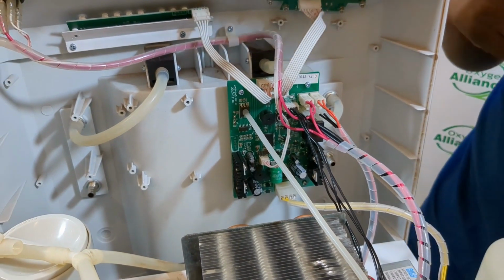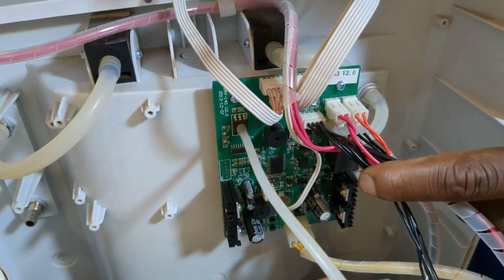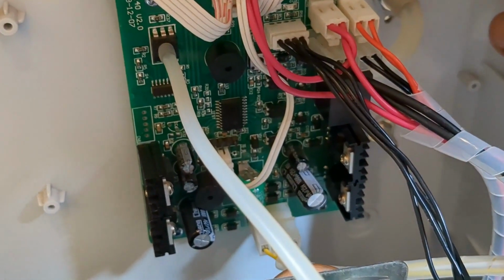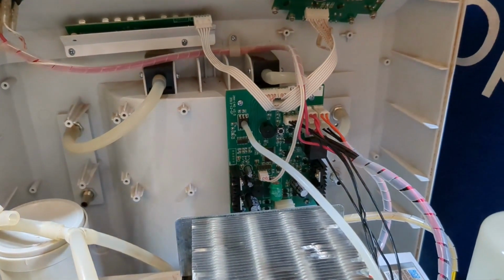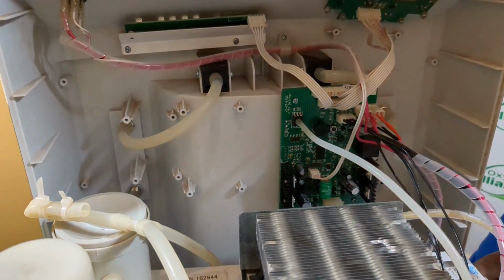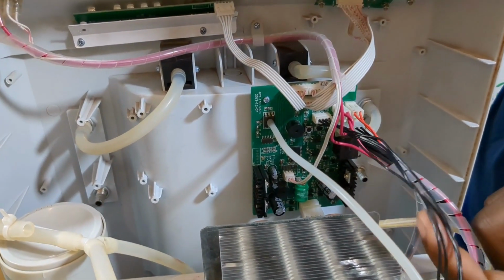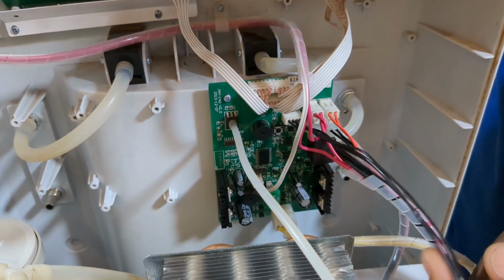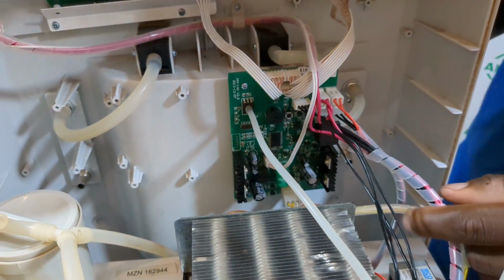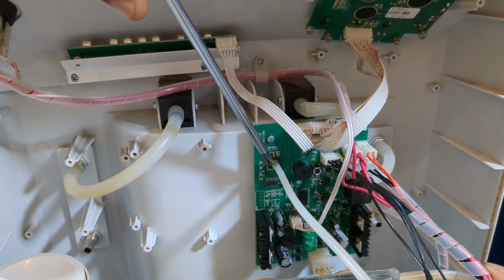And the main component of this board is this right here. This is a PIC microcontroller, and it is the brain of this circuit board. This microcontroller is responsible for all operations on the printed circuit board. The first thing it is responsible for is switching on and off the four-way solenoid valve through this wire harness. It is also responsible for reading the voltages, the signals coming from the pressure sensor, and interpreting them.